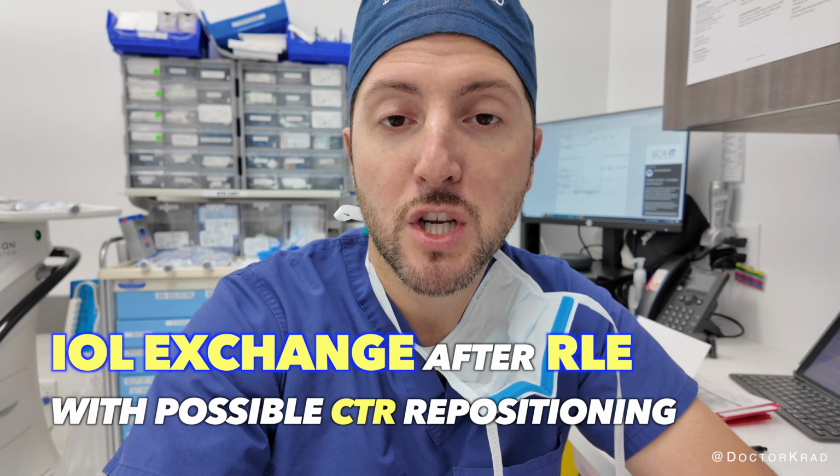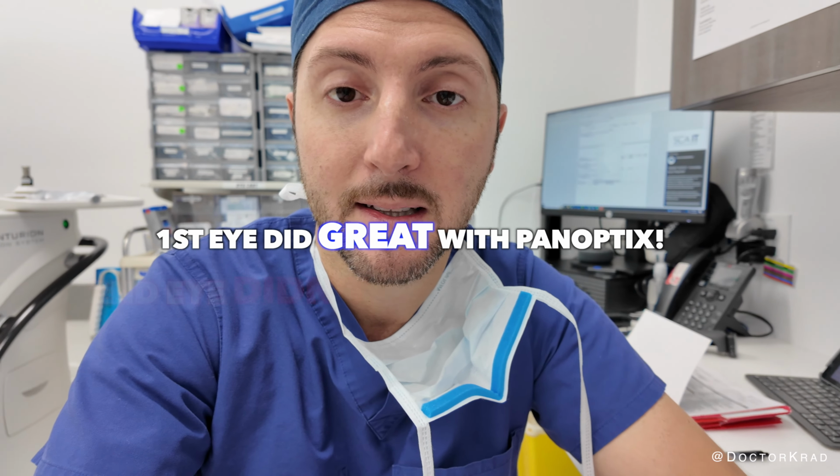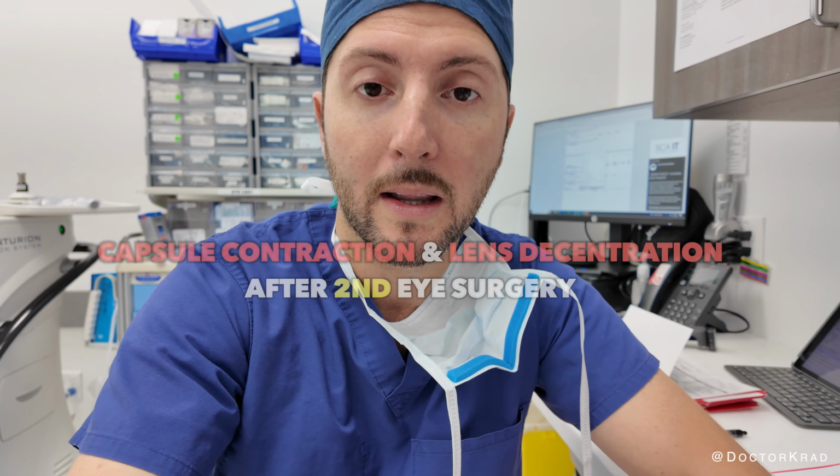Hi, everyone. Today I have a really interesting case. A patient was referred to me. She is a young lady who had refractive lens exchange, and she had Panoptix lens implants. However, after the initial surgery, the lens implant wasn't centered very well, and the patient had poor quality vision.